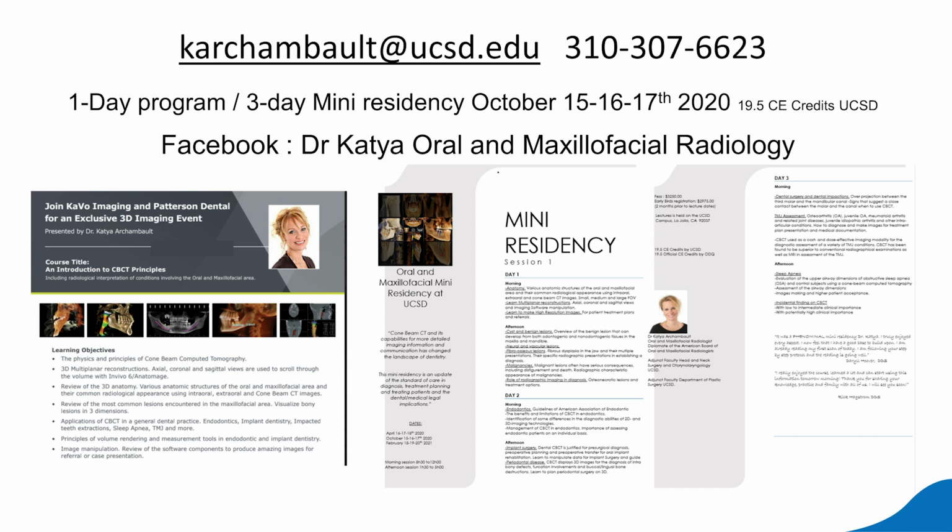We also go over sleep apnea, how to measure the airway. Of course, CBCT is one of the tools that you can use, but it's not the diagnostic tool to diagnose sleep apnea. You need to go to a sleep study test, and you need to consult with sleep medicine, of course. But you can measure airways on CBCT.